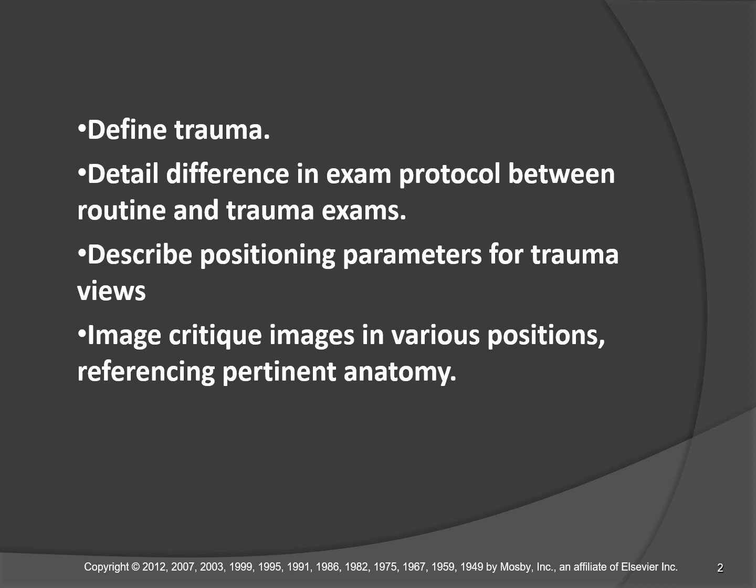You need an x-ray tube, you need a patient's body part, and then you need an image receptor on the other side. And we know that x-rays travel in straight lines, so those objects A, B, and C, as we learned last fall, have to be in a straight line. Otherwise, you're not going to catch the x-rays out the other end of the patient. So A is the x-ray tube, B is the body part, C is the image receptor.